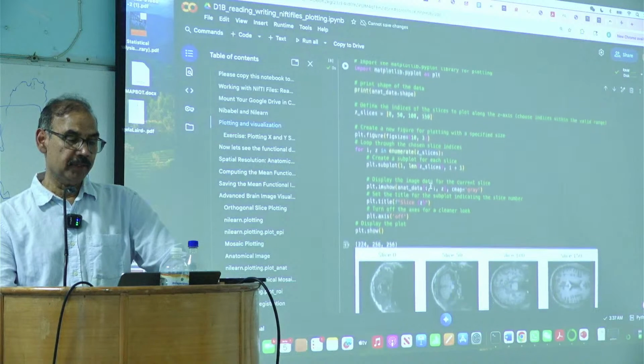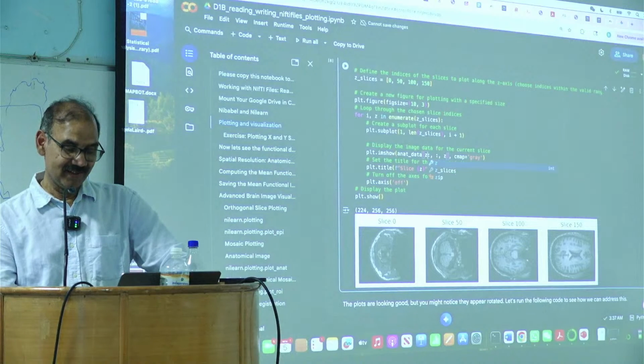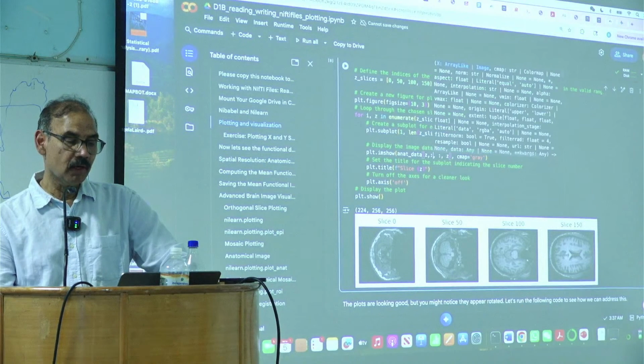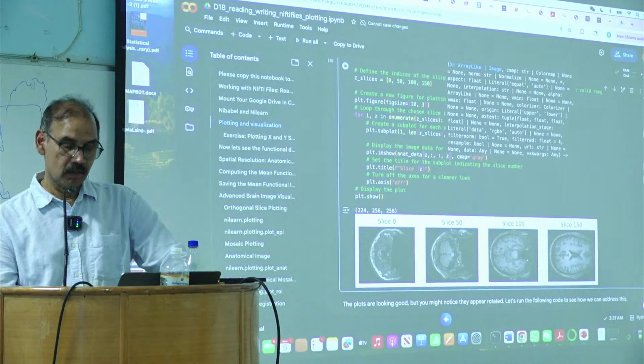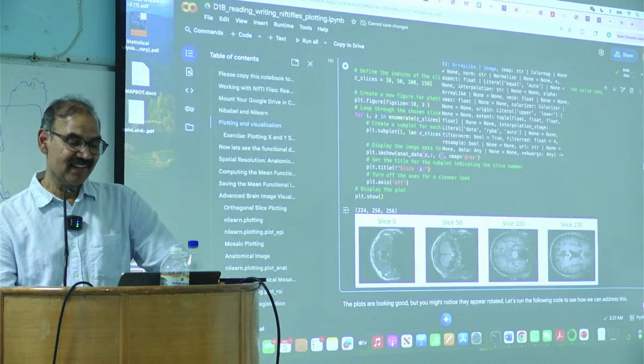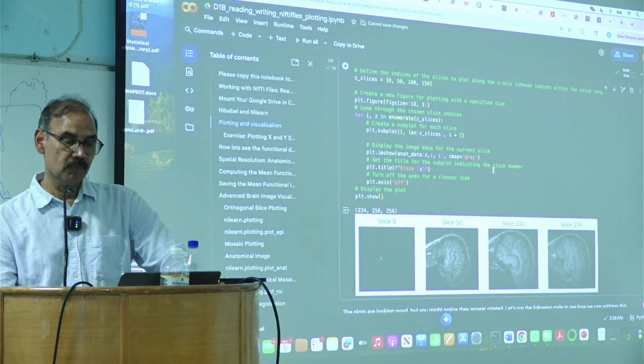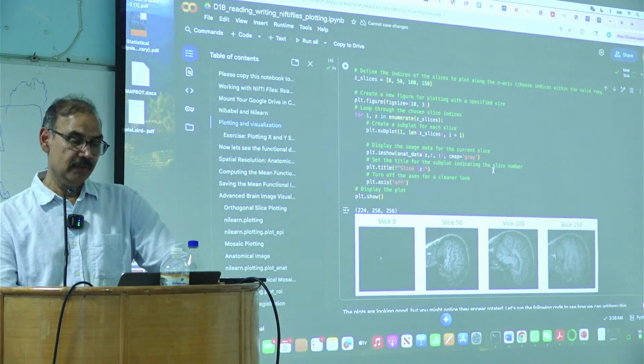If we wanted to do it for the other dimension, right? Is this okay? Right, so this is what you will get.